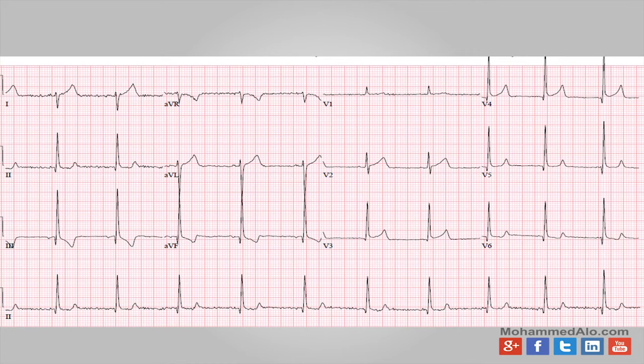But you've got RVH here, which is a right-sided or pulmonary strain pattern. You got an S that's depressed, a Q wave, and a T that's inverted in 3. That usually we call S1, Q3, T3, and we say it's an RV strain pattern or pulmonary strain pattern. Usually we say it has to go with PE. The top 5 findings on an EKG in somebody with a PE are sinus tachycardia, sinus tachycardia, sinus tachycardia, sinus tachycardia, 5 out of 5 times. You rarely ever see this pattern, especially in an acute PE.